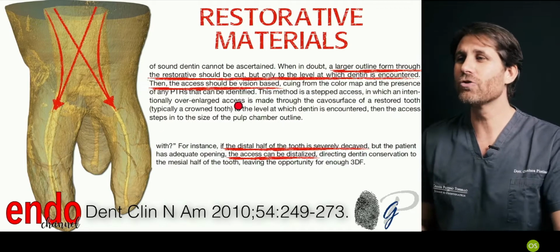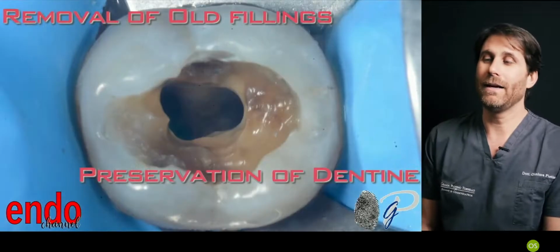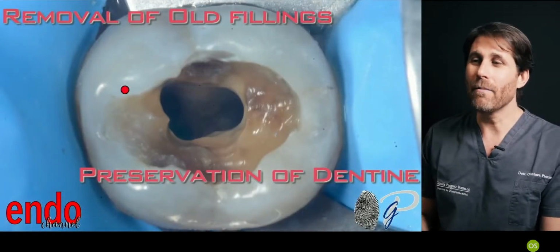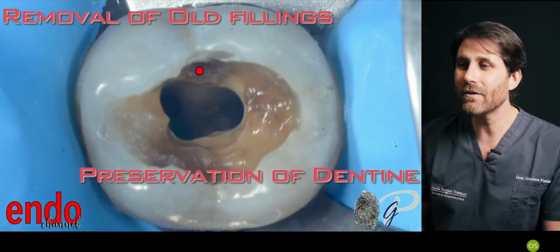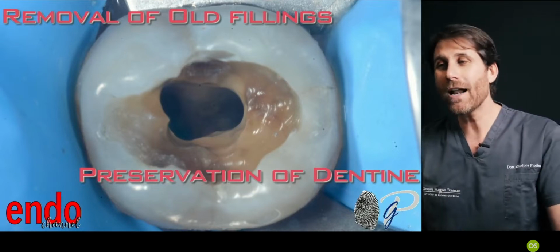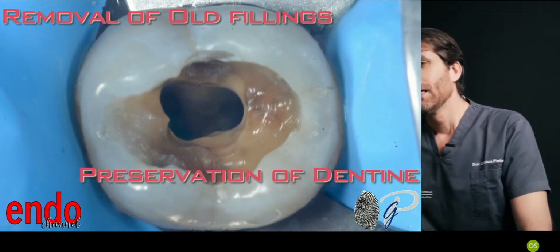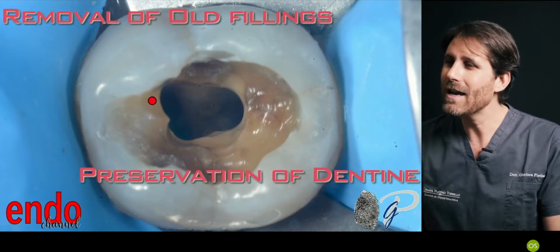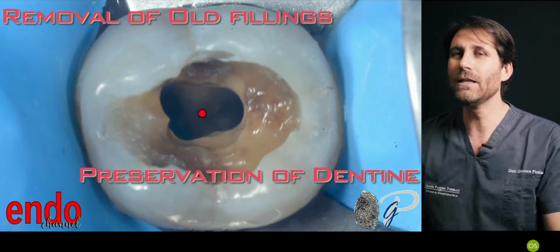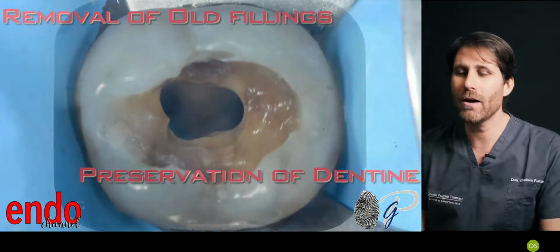Then the access should be vision-based. When we remove the dentin, we should first remove the filling material on the occlusal surface, so you can have better visibility there. You can have more light going inside these root canals. This will help you increase the visibility while maintaining a very small access cavity. So when we are indenting, just remove the smallest amount of dentin possible.